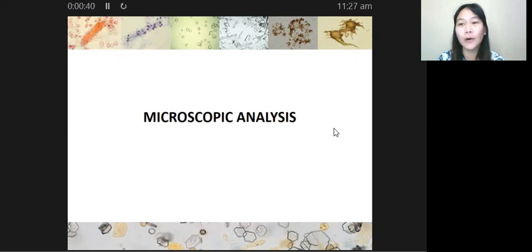So for this video, we will be discussing microscopic analysis. Of course, this will serve as a complementary material to what you have already finished in your lecture. Without further ado, let's start with your microscopic analysis.